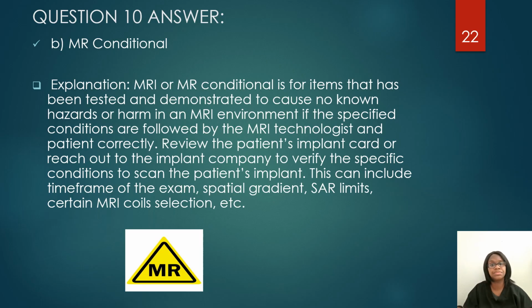MRI conditional. With MRI conditional implants, a lot of techs get this confused, whether they're new or old. So if a patient comes in with an implanted device, whether it's a pacemaker, a stimulator, stents, aneurysm clips, whatever they come in with, if their card has this label on it, which you should also know, it's yellow for MRI conditional.